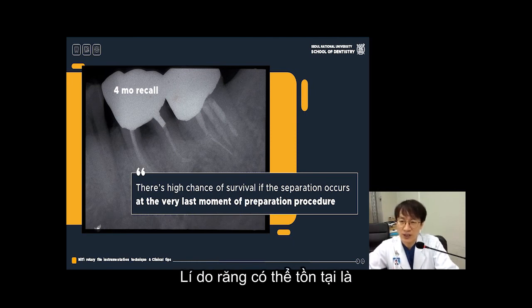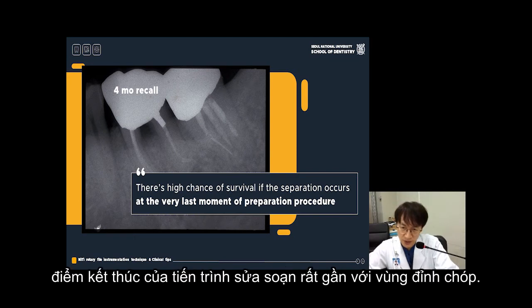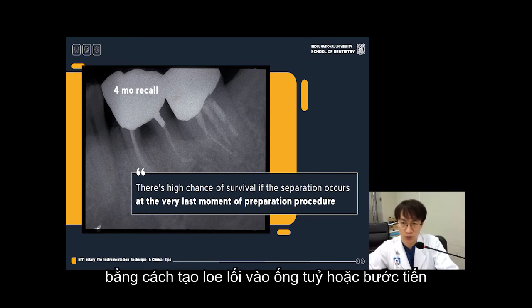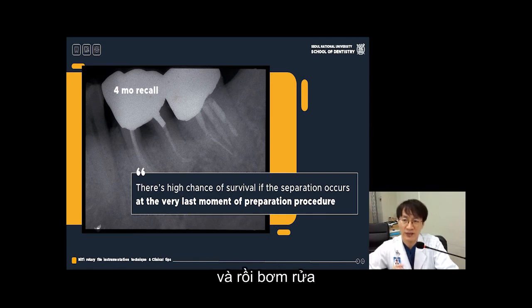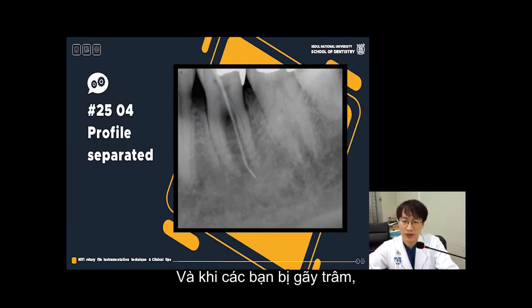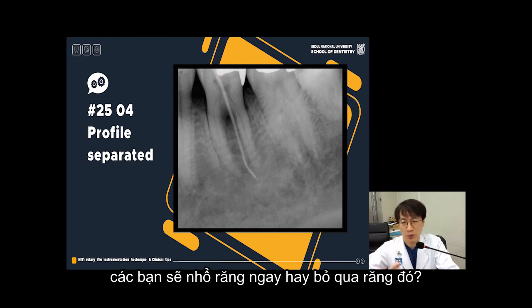So the reason of the survive is the preparation of the tip area is the very last end of the preparation procedure. So try to remove the infection from the beginning by like coronal flaring or crown down, and then irrigate, and then use the lubricant that will help you to avoid the failure even though you have separated. And once you have separated file, you're gonna extract it right away or ignore that tooth? No, you have to follow up.